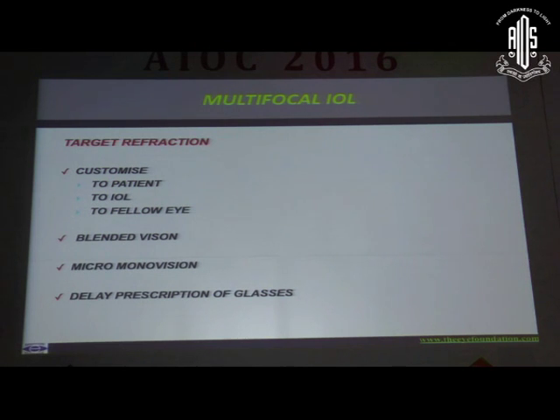And the most important factor that I want is reliable refractive outcomes in the first eye. We are never promising total spectacle freedom as far as these patients are concerned. What we are telling them is relative spectacle independence once they are bilaterally implanted. Depending upon the outcome in the first eye, I titrate the power that I am putting in the second eye so that bilaterally implanted, they are reasonably effective for all distances, distance, near and intermediate. So the refractive outcome, the comfort level of the patient for all distances in the first eye is extremely important for me to determine what exactly is the lens power that I'm going to put in the second eye.